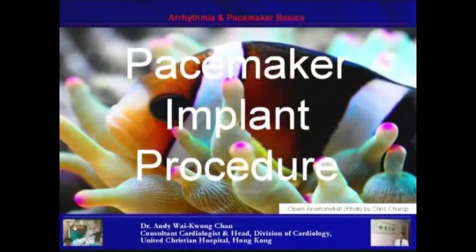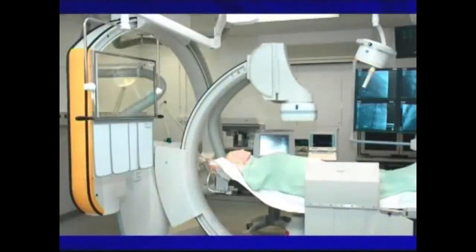In this section, we'll discuss the pacemaker implant procedure. We usually implant the pacemaker in the cardiac catheterization laboratory with an X-ray C-arm. This X-ray C-arm allows us to screen the lead when we're putting in the lead through the vein to the heart.